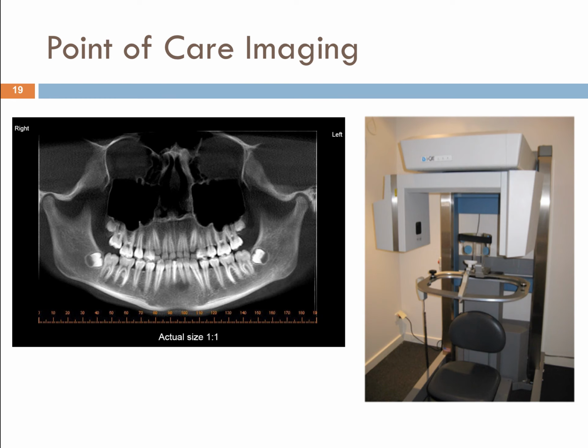It's able to be placed into a room. It's a purpose-built CT scanner for dental applications, so it's not for doing knees or shoulders or chests or heads or anything like that. I think the future probably holds much more of point of care applications, and much more in terms of being able to qualitatively and quantitatively assess images.